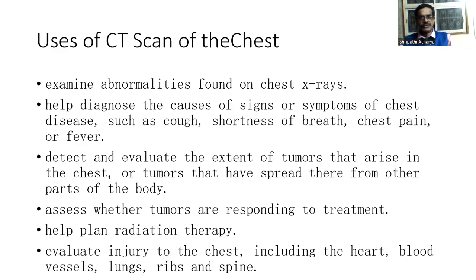Now let us see the uses of CT scan of the chest. In which conditions CT scan is indicated. It is used to examine abnormalities found on chest X-rays. It helps to diagnose the causes of signs or symptoms of chest disease, such as cough, shortness of breath, chest pain, or fever. To detect and evaluate the extent of tumors that arise in the chest, or tumors that have spread there from other parts of the body.